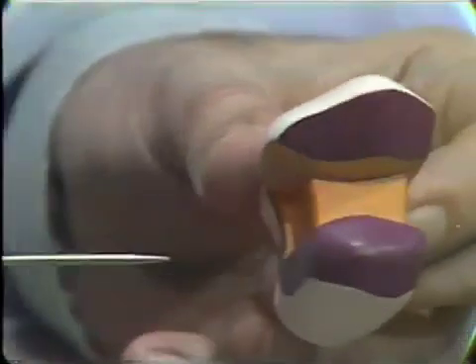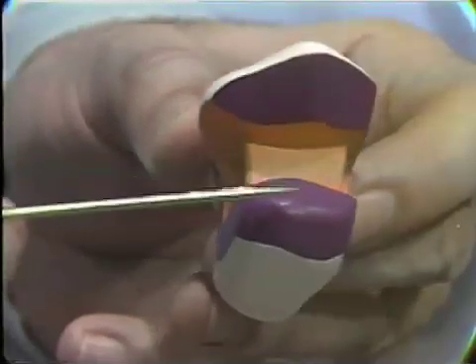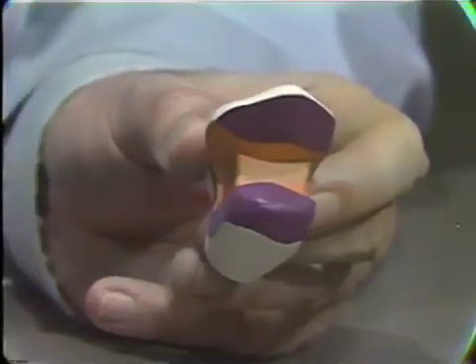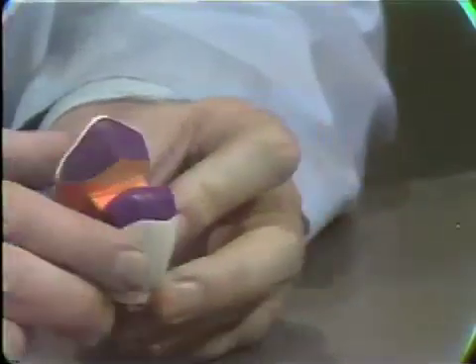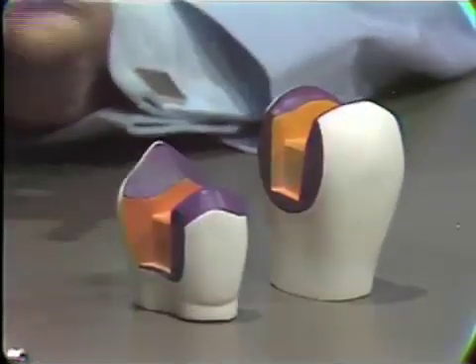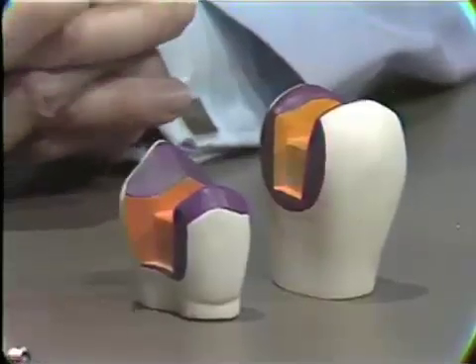It's possible in these situations, if necessary, of course, to place additional retention by means of pins, and these can be placed down in the cervical, perhaps one on either side here, or they can be placed in the tips of the buccal cusp if due regard is given to the position of the pulp chamber, and these will give additional retention in this type of situation. The MOD inlay, then, a useful type of bridge retainer in cases where previous restorations are present in teeth. Can be used, of course, on bicuspids, as shown here, or also on molar teeth, either in the maxilla or in the mandible.